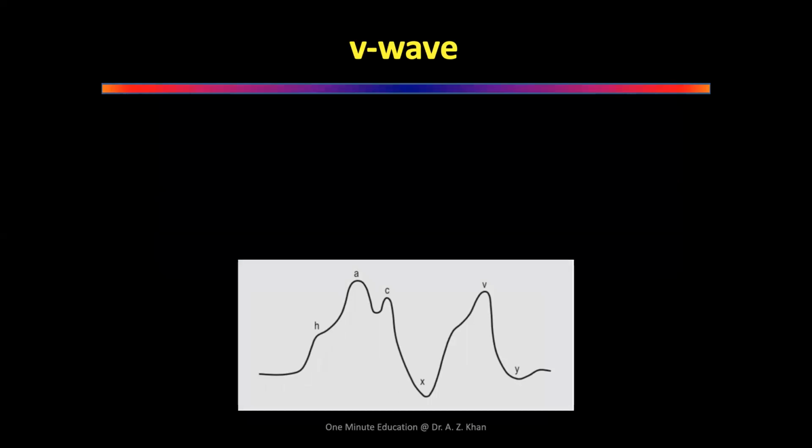V wave. What is this V wave? This is all activity happening in the right atrium. So what is the V wave?